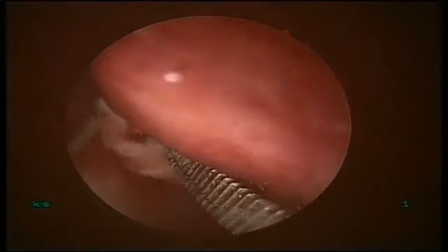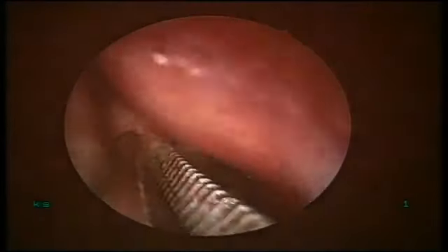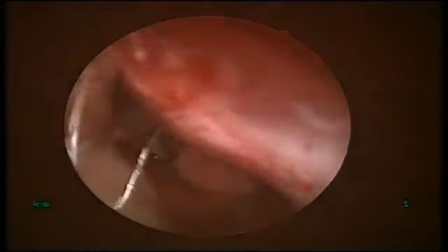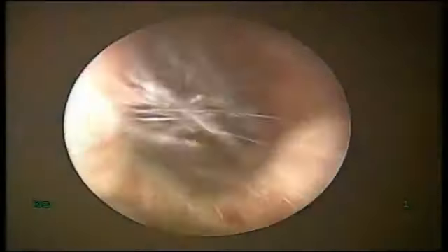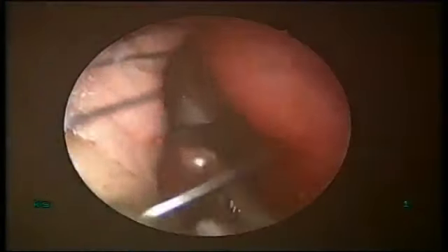Pre-op, that is to reach the correct diagnosis. That is the diagnostic part. Hard is good. Soft means there could be a common canalicular block. So if it is soft, get the DCG done.